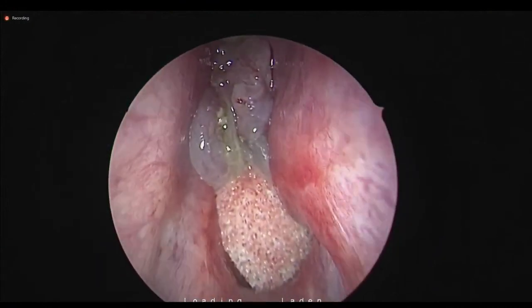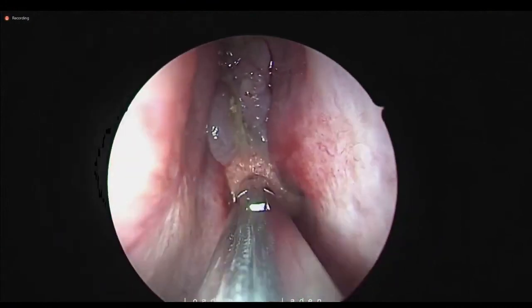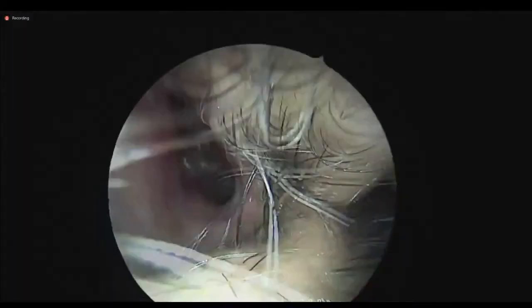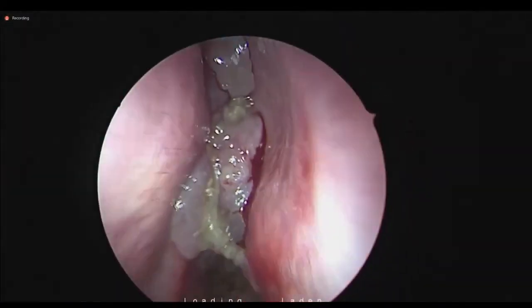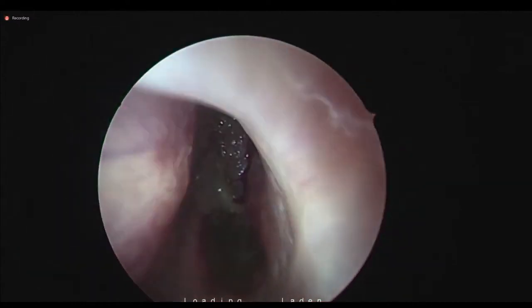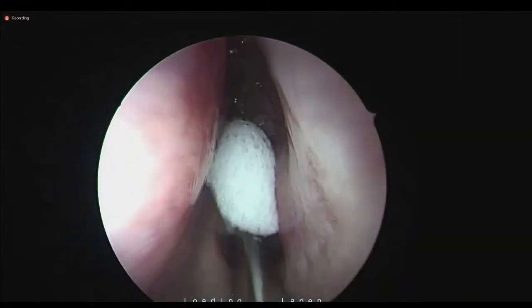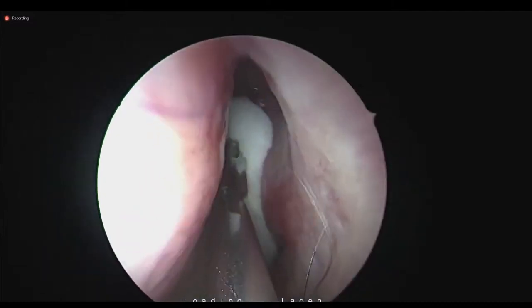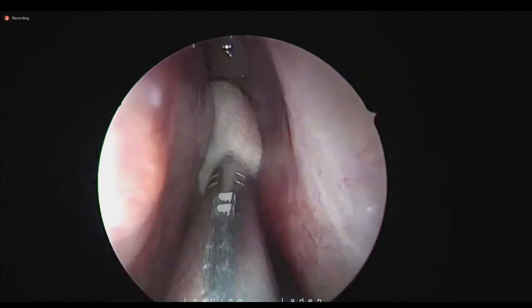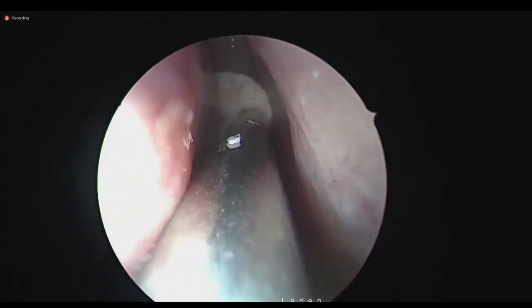And this bleeding, to understand, is basically not from major arteries. This is purely from the capillaries. And here the most important parameter which minimizes the bleeding is reducing the cardiac output. And that is achieved best by reducing the heart rate. That's it. You don't need to give hypotensive anesthesia or do anything.